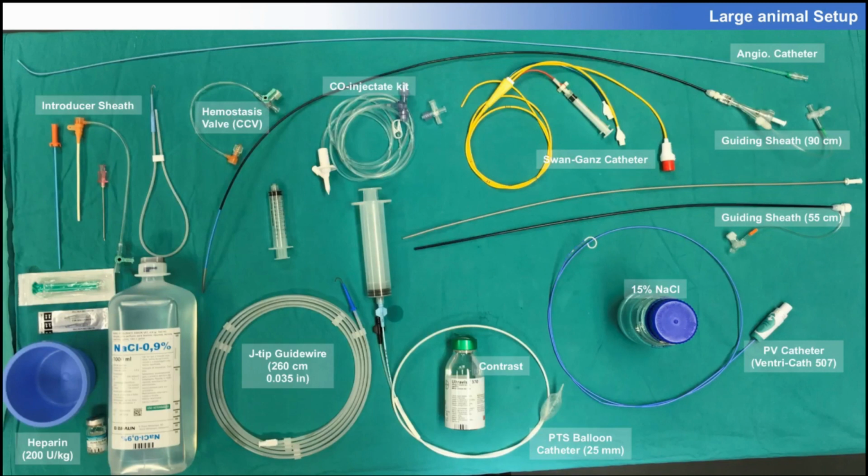So in terms of the consumables we need to perform PV loop analysis, this is an overview of what you usually use. And during the next slides and videos, you will see a demonstration of their use. So first, we have our introducer sheaths on the top left, which are the entry point into the vascular system of the animal. Then on the top, we have our angiographic catheter, which although it is usually used for coronary imaging, we use it to help guide our J-tip guide wire into the left ventricle when we need to.